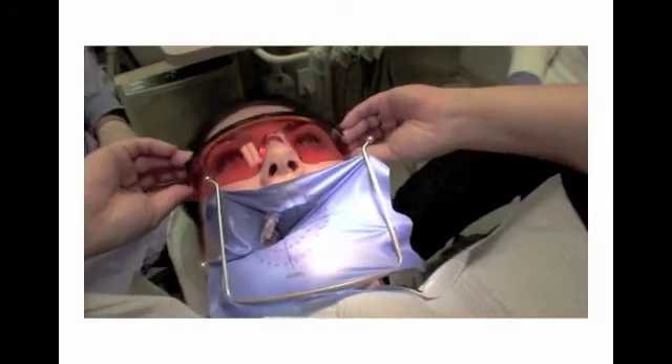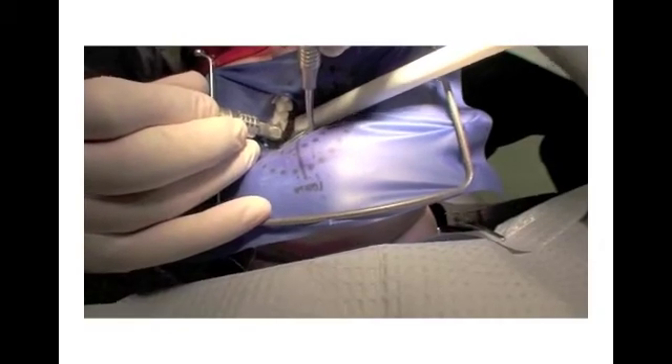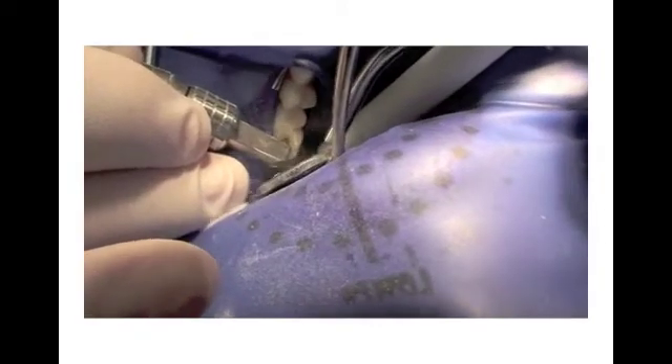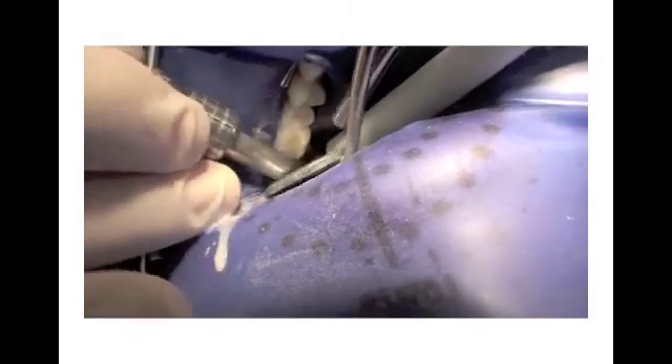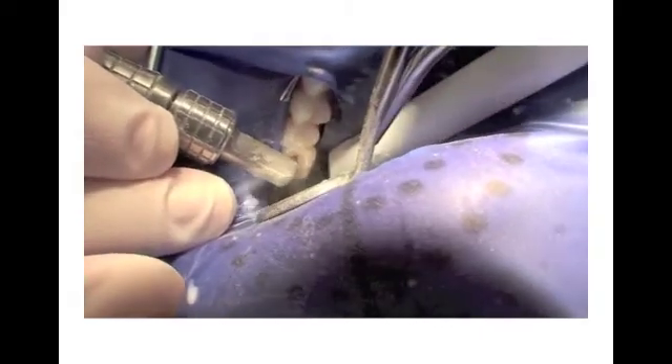Isolation of the tooth is essential with a rubber dam, an isolate-type device, or damp gauze. Always wear your personal protective gear and provide eye protection for your patient. The PrepStart H2O handpiece is about half the size of a conventional turbine or electric dental handpiece. This provides better access when treating smaller pediatric patients, or when you're near the rubber dam clamp.